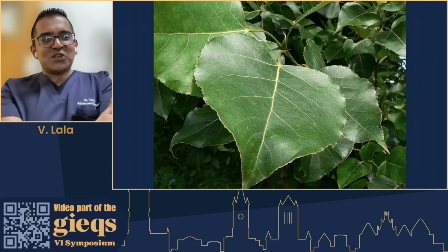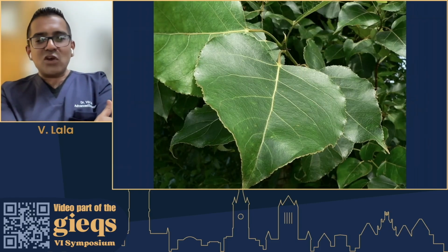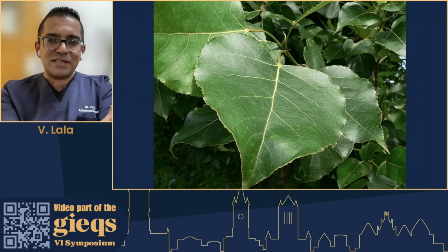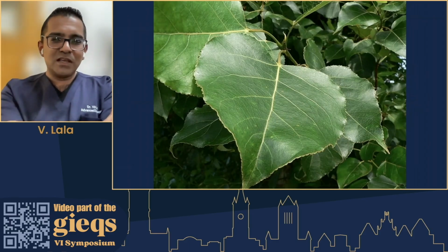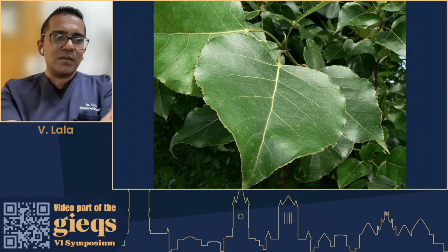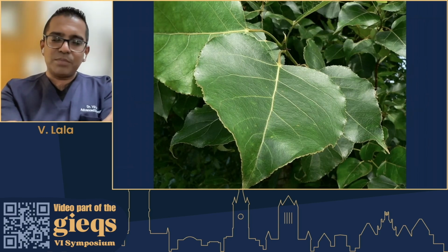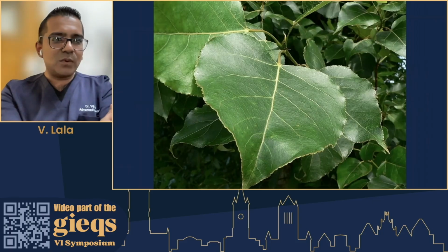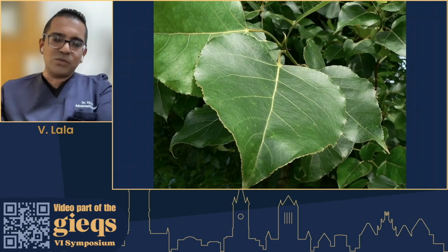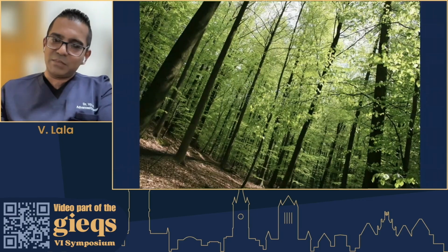So we spent the whole morning speaking about optics and about getting close up and about looking at mucosal patterns and tight crypts and crowded crypts. And the point that I want to make is that when you're talking about a broader everyday endoscopy audience, we sometimes get caught up in optics and pit patterns, and we miss the bigger picture. So if you spend too much time looking at the leaves and analyzing the veins on the leaves, you can miss stepping a little bit back.